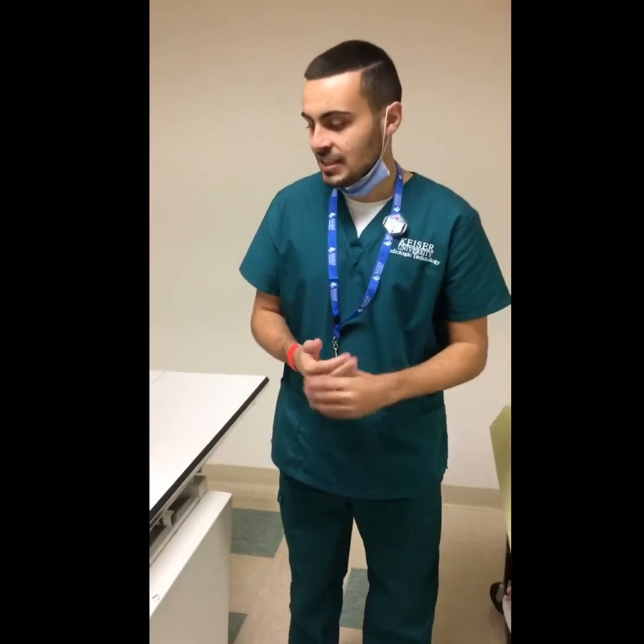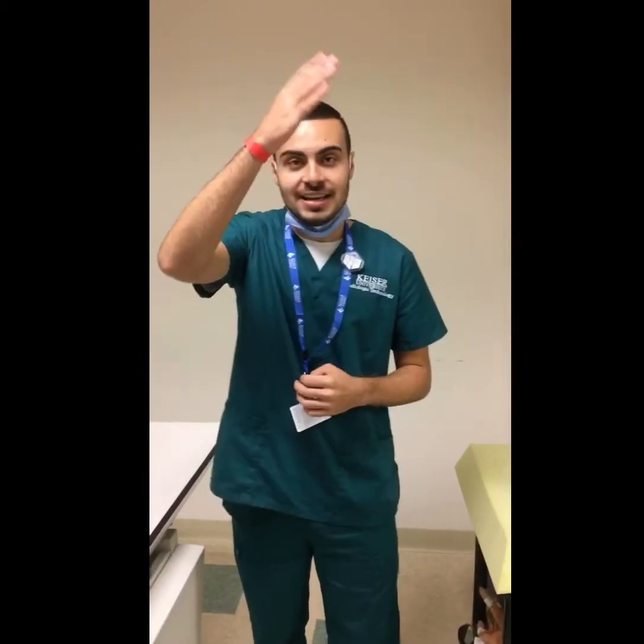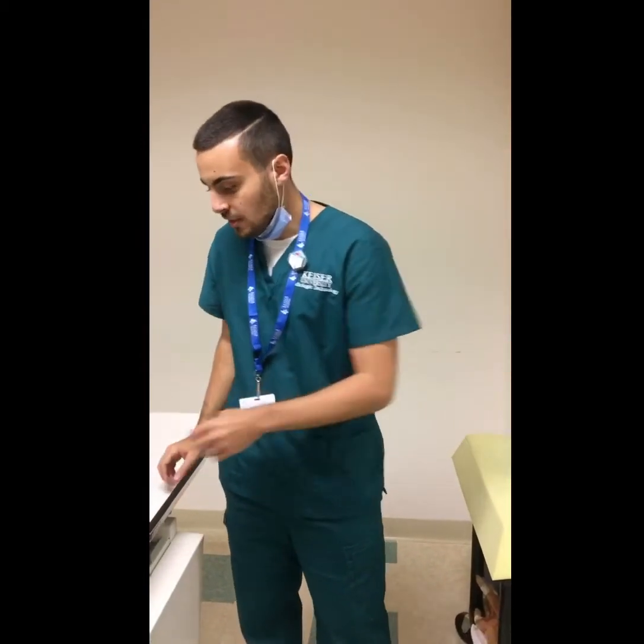Okay, so now we're going to be going over the Moiré effect, also called the zebra effect. Basically, we use a double grid for patients who have an increased body thickness. And with this double grid error, when we go over the image, you're going to see stripes that look like zebra stripes because of the two grids that we're using.